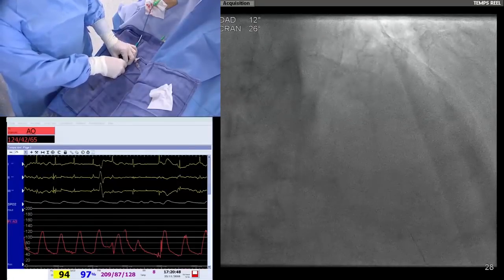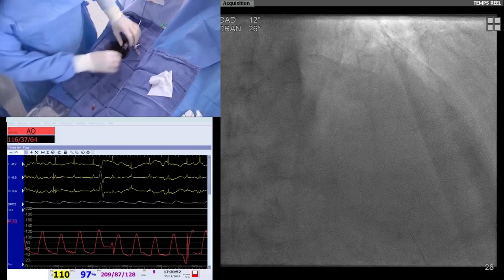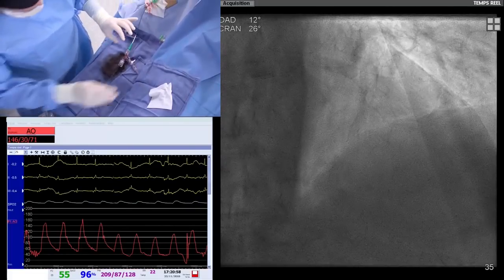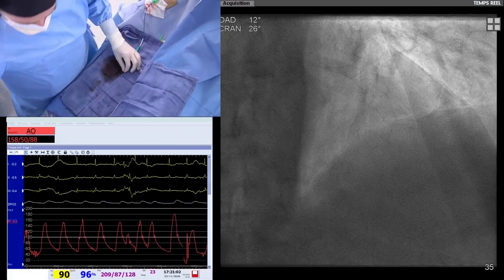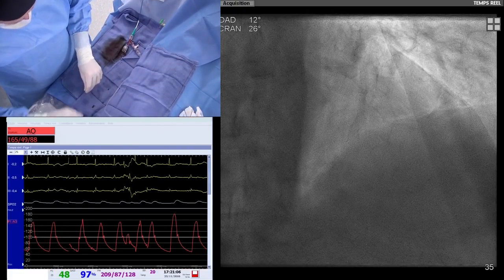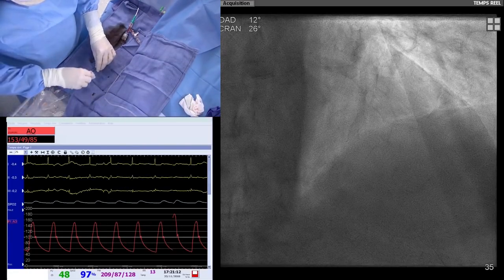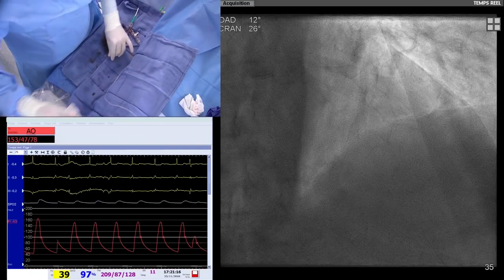It's an important practical point: for the exchange I will disengage the guiding, because we have to prepare the ROTAPRO and discuss. I also have to pay attention to the wire, because I have to avoid any angulation of the wire, which could compromise or decrease the crossability of the burr and the performance of the rotablator.